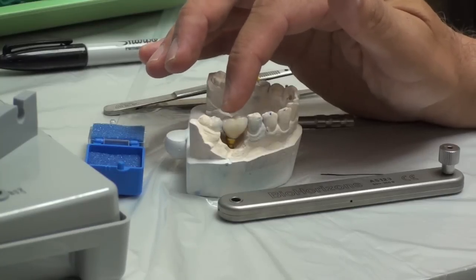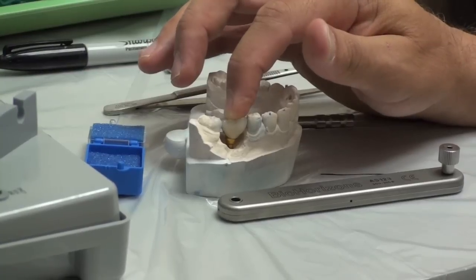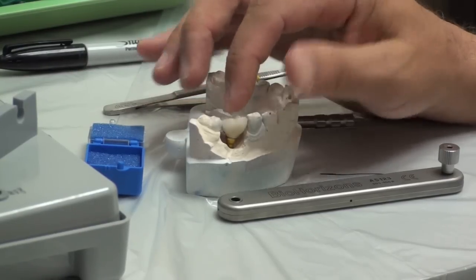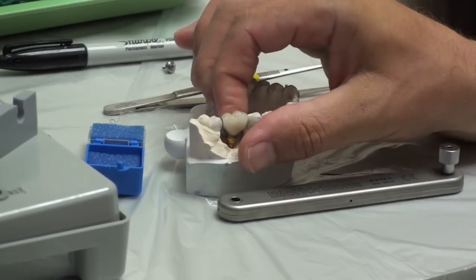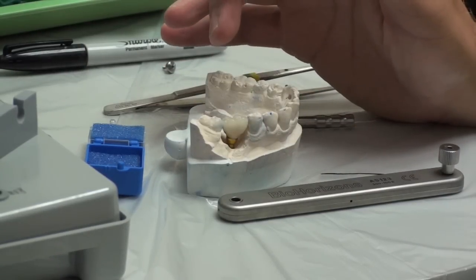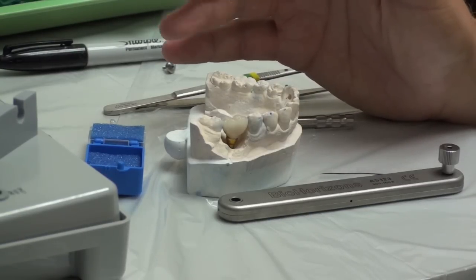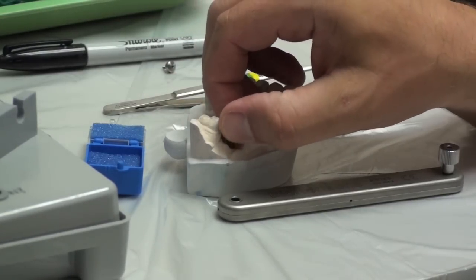So you've adjusted the tissue contacts, you've adjusted your tooth contacts, and you've taken an x-ray and your crown is fully seated. Only then should you start adjusting the occlusion, because until that point you don't know that this is down all the way. There's no point in adjusting the bite if the crown is jacked up because of the tissue. So you get it down, do your normal occlusal adjustments, and when the patient's comfortable with it - and of course you've checked and approved the color with the patient - polish it up and get the doctor to seat it.